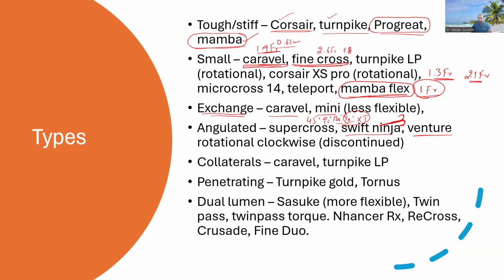The issue with this catheter is that it has a much larger tip, and frequently when you need it, you cannot use it because the vessel is small in size and it cannot completely flex. You cannot lock this one. It is made by Teleflex. There's an 8 millimeter tip. Okay, so that's the issue. You really need an 8 millimeter, actually not 8, but like a 5 to 6 millimeter size vessel to work on this. So it works in very large vessels, or if you're in the left main and you're trying to go into the circumflex artery, it may work in there. And it was discontinued. I think it's back again.